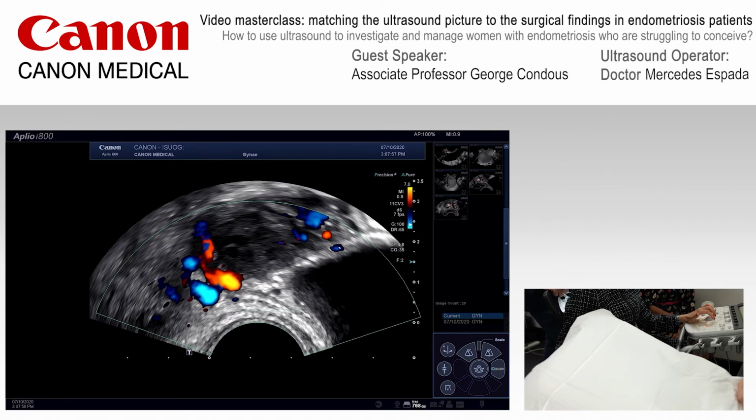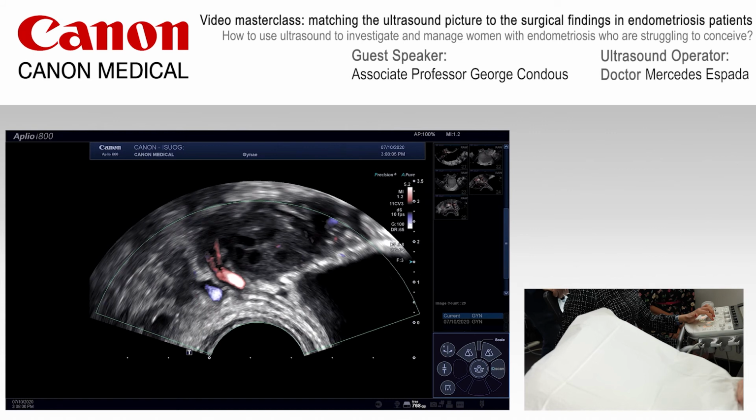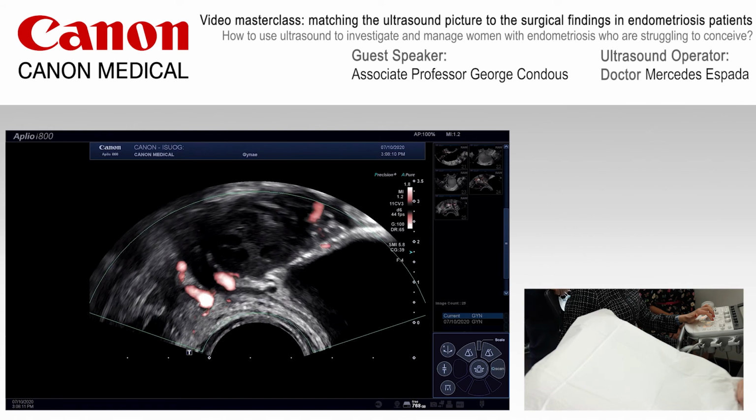And we follow that ureter proximally. You can see it right the way there, back to the pelvic brim. So hold that there and we'll see if we can get some vermiculation. We've looked at the systematic approach to uterus, ovaries, ovarian mobility, sliding sign to assess the pouch of Douglas. And we've also looked at the different potential locations based on a compartmental assessment of the pelvis anteriorly and posteriorly.